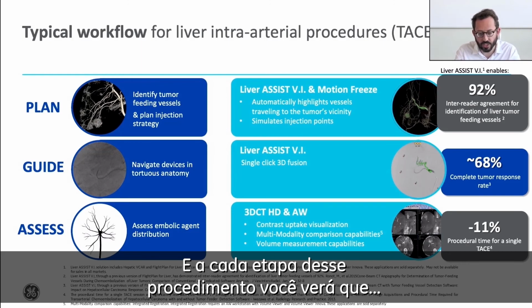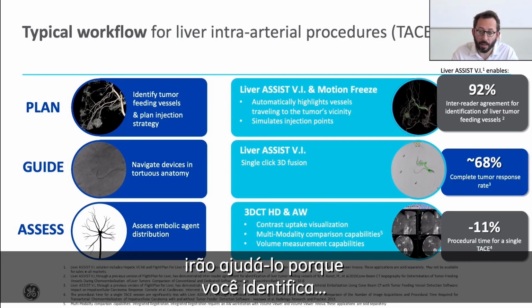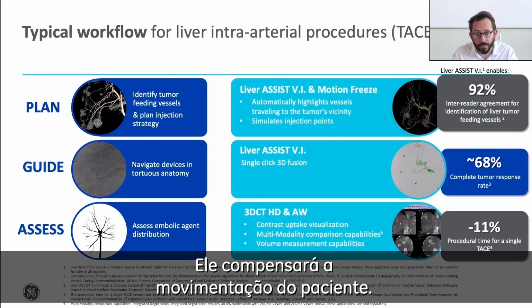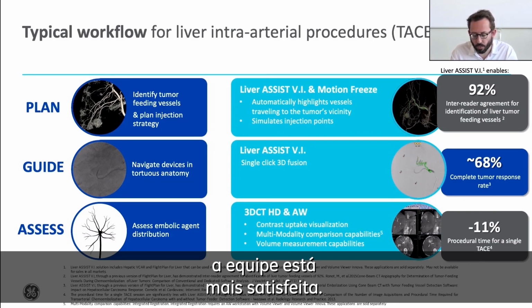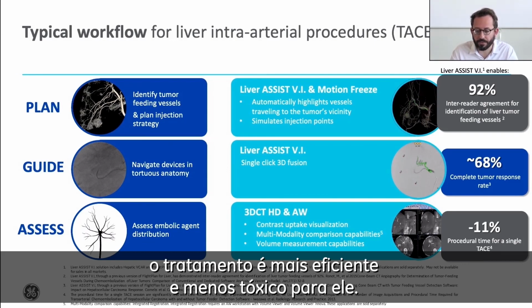And at each step of this procedure, you see that live versus VI, motion freeze, and the 3D high definition package will help you, because, as I showed you, you will identify more tumors, more feeders, and be more confident when you navigate through them. You will compensate for the movement of the patient, so you will use the 3D images more frequently. And at the end, it's very nice to see that you're more confident and the team is more satisfied, but also the patient will benefit from that, because the treatment is likely to be more efficient and less toxic for them.